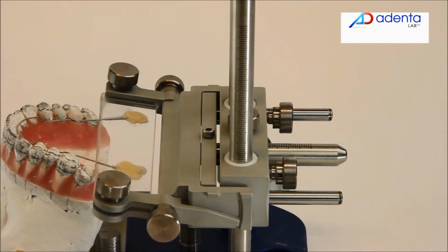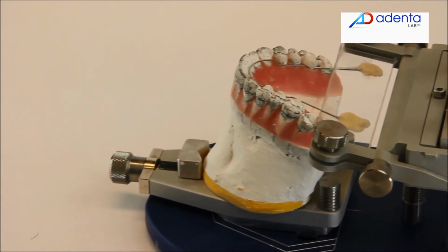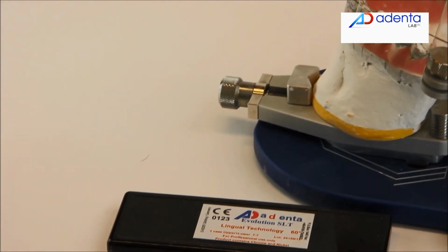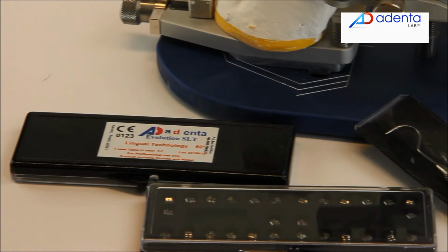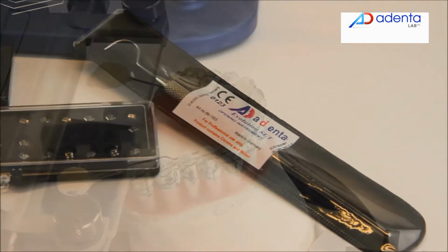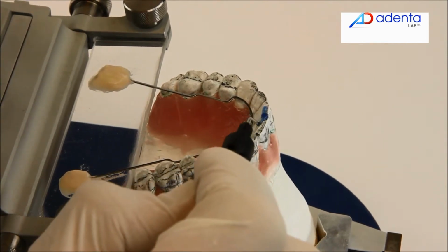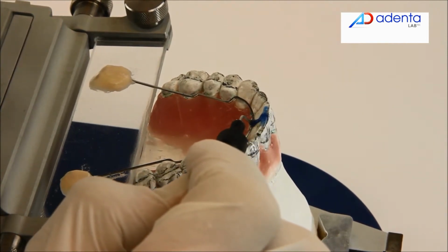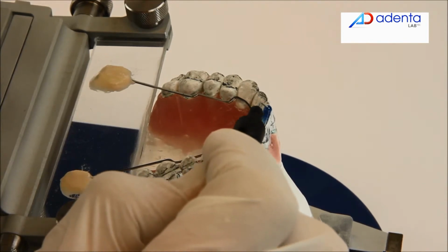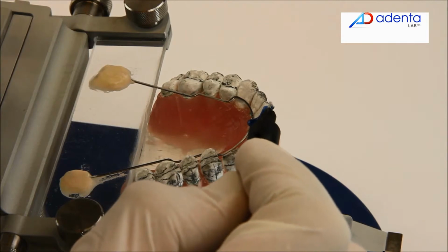In this case, ADENTA's Evolution SLT self-ligating brackets are used. To achieve larger stability, use the composite or blockout resin to make the anterior reference in the arch.